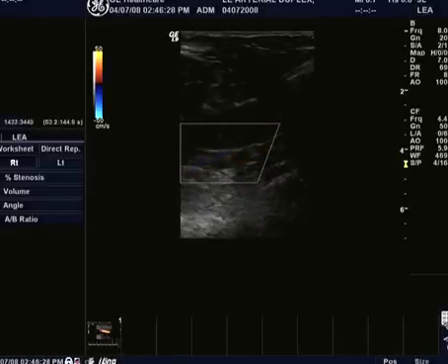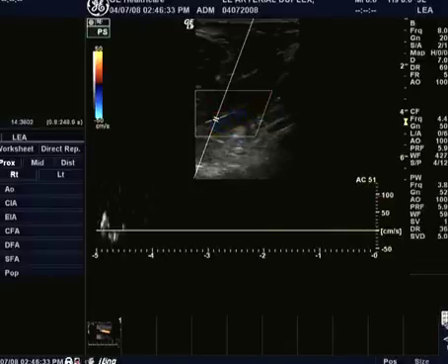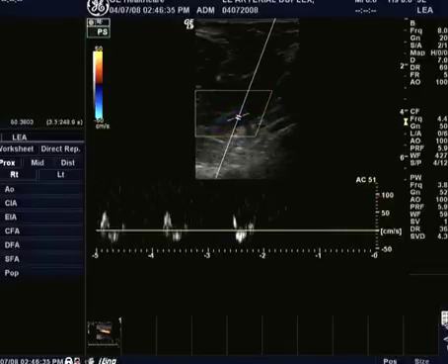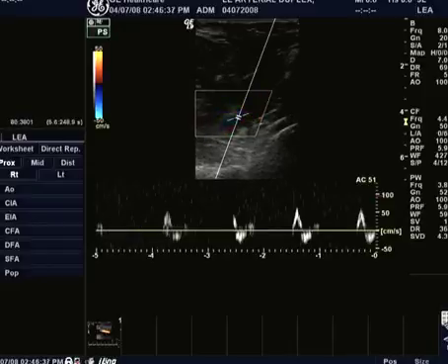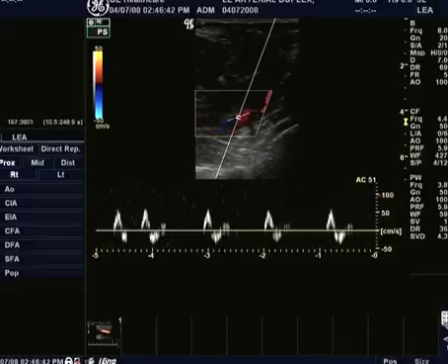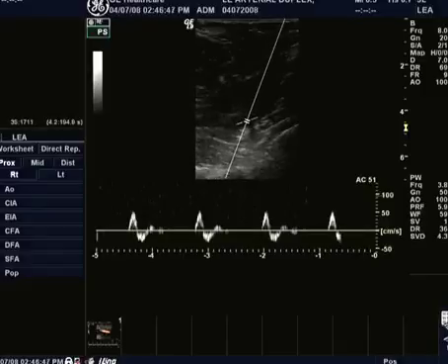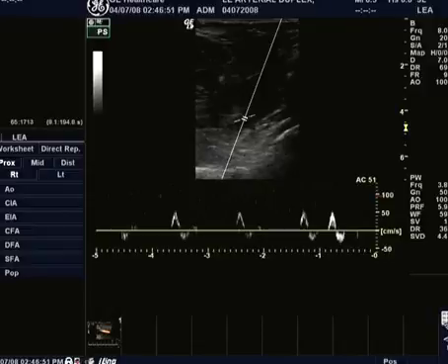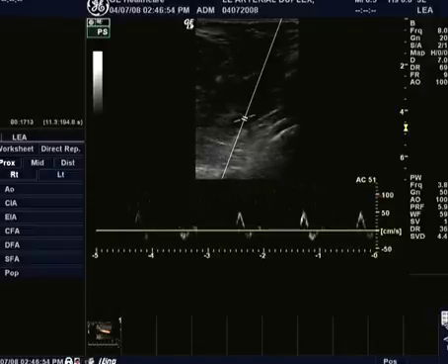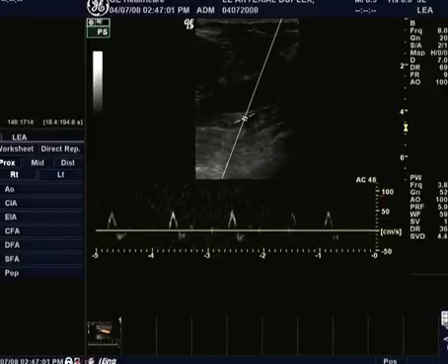What we'll do again is we want to get a couple of Doppler signals. There's a lot of little branches that come off. This is a prominent place to have some pathology form, so we want to make sure. If we ask the machine to do too much, we can turn the color off and just grab our spectral Doppler. And what we're seeing is the same thing we saw before. Just change our angle just a little bit. We're listening and looking a little bit deeper.